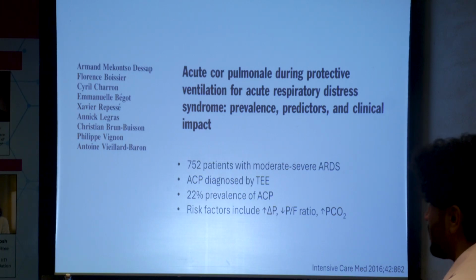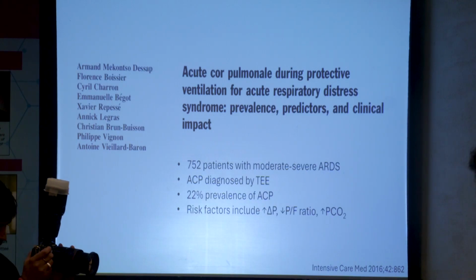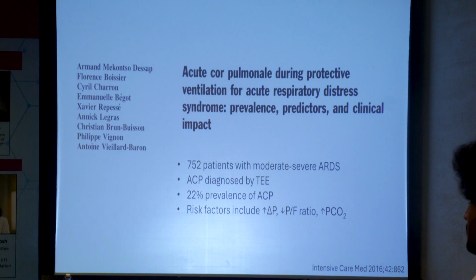Yeah, so dialysis is a good question, and it's challenging with the access. It is possible to run CRRT through the ECMO circuit, which is what we prefer when it is technically feasible, so we don't have to have separate dialysis access.